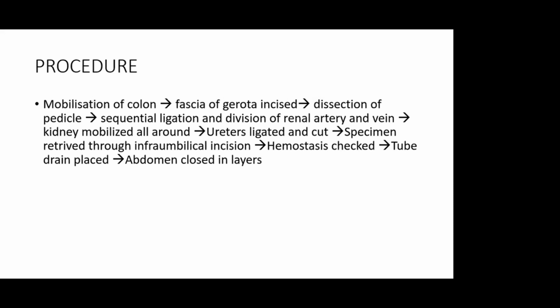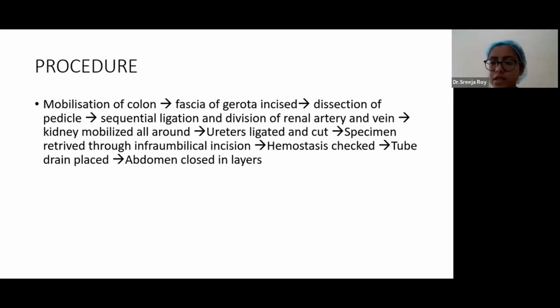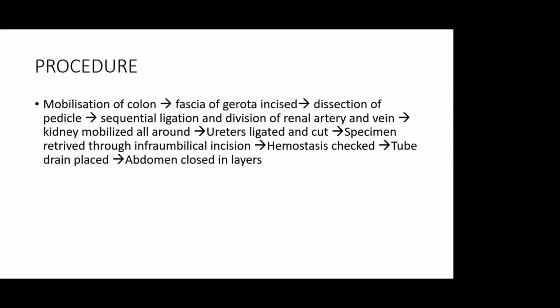What should be the position of the patient? Position of the patient will be kidney position, as I have mentioned in the open loin approach. The patient will be placed in the lateral position. In most cases it is done with a totally lateral approach, but some surgeons also prefer a semi-lateral position, that means 30 to 45 degree flank up. Means in supine, and you pad up posteriorly on the side you are operating.